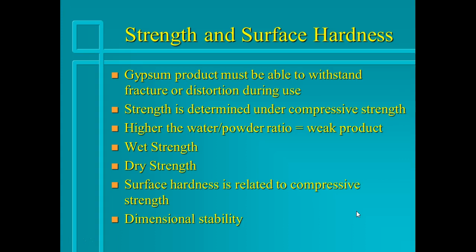In regards to dimensional stability, the dimensions of a hardened or set gypsum cast are relatively constant under ordinary conditions of room temperature and humidity. However, gypsum is slightly soluble in water. Occasionally, it is necessary to soak a cast in water for a laboratory procedure. If the cast must be soaked in water, the water should be saturated with gypsum to prevent erosion of the surface.